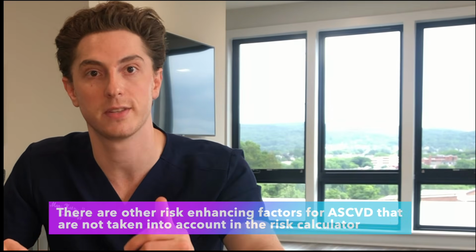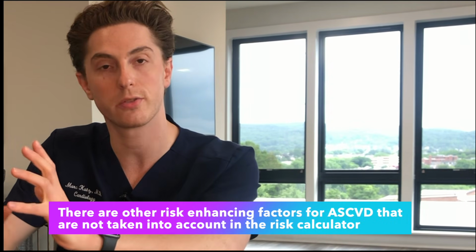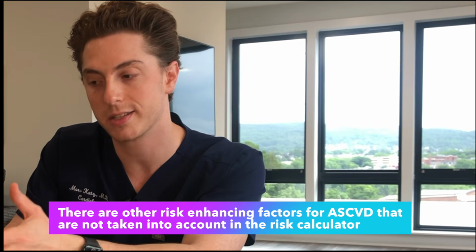But that is the crux of this video, and that is the importance of coronary artery calcium score, because these are the only risks that this calculator takes into account. And that's where a coronary artery calcium score can really come in handy. So if this risk calculator has you at a moderate or intermediate risk, a coronary artery calcium score can push your risk lower or potentially higher.